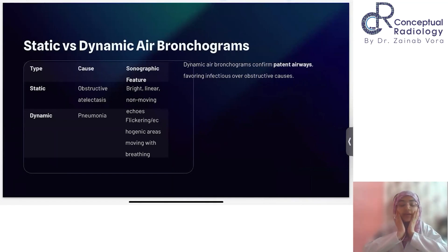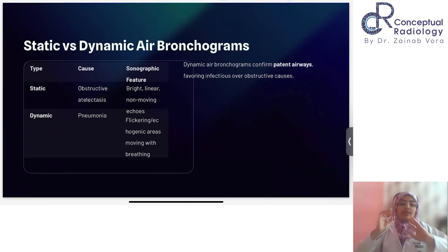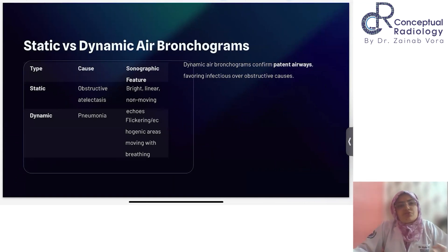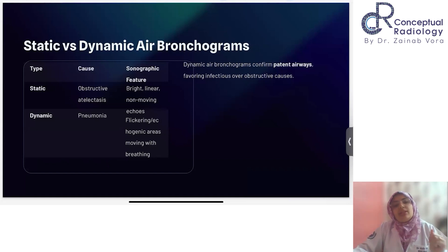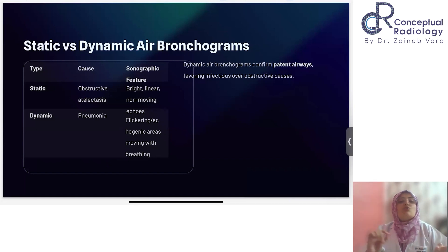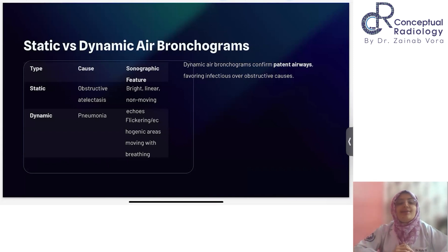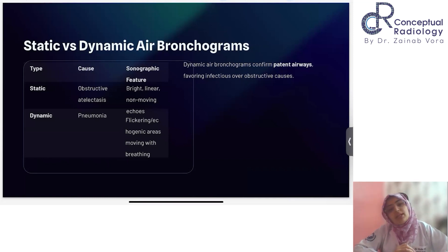Firstly, there is a concept of air bronchograms. This is easy to understand, especially when you have reported an HRCT. There is a patch of consolidation which appears white, and in between that, these are branching airways filled with air, appearing black in the background of that white patch of consolidation. It is really easy to visualize the concept of air bronchogram.